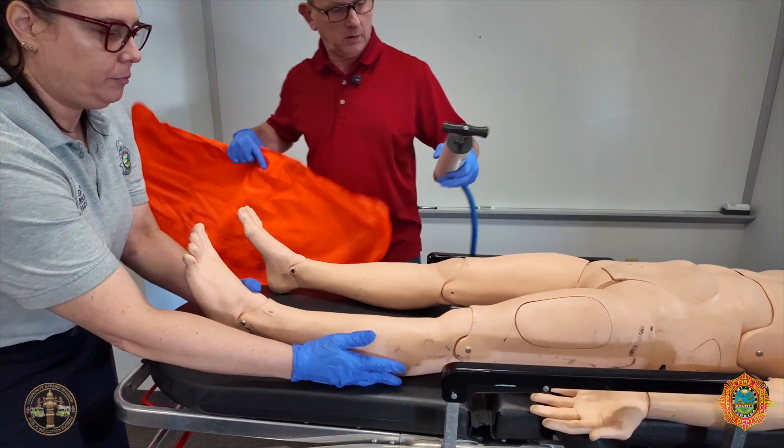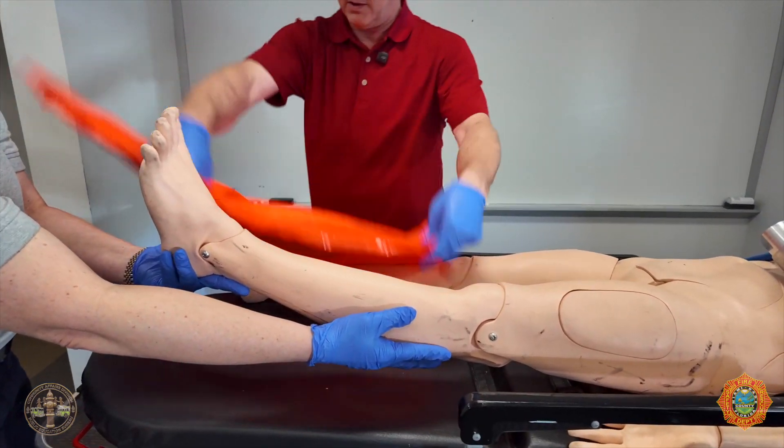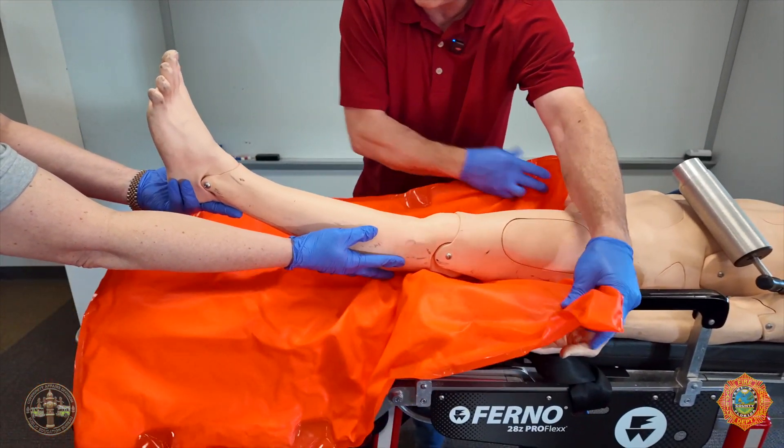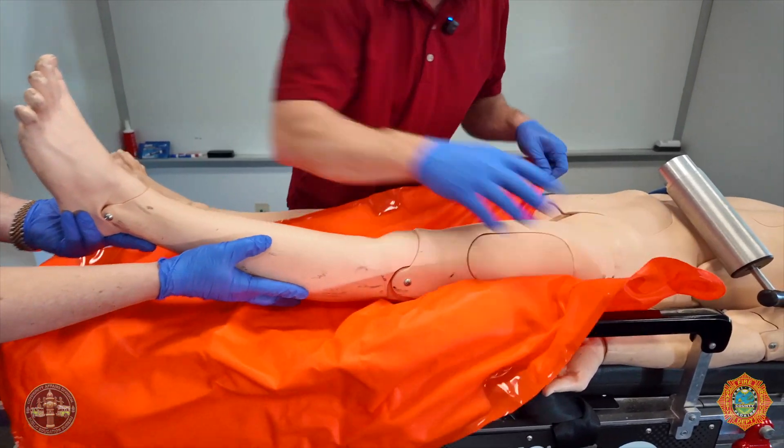You'll hold this leg up a little. Slide this underneath. The wide end goes towards the hip. The narrow end goes towards the ankle.